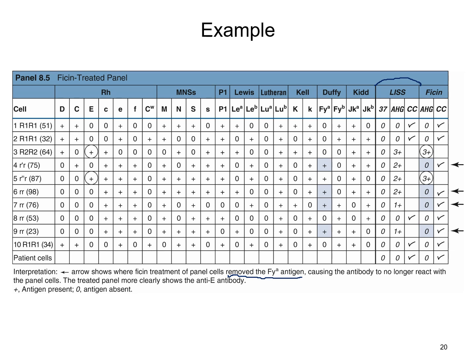But if we were to do our rule out based off of this first scenario, so I'm going to do this in blue, then the particular rule out for the cells that we're going to use is going to be these ones that reacted negative. So it's just cells 1, 2, 8, and 10. Of course, we always want to look at our auto control. Is our auto control negative? Yes, that means we know we're dealing with an allo, not an auto. And we'll go through our rule out process.